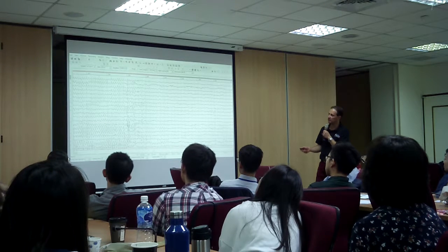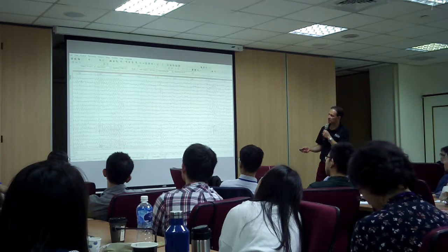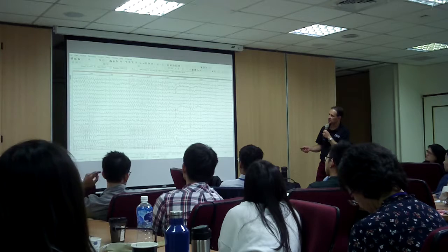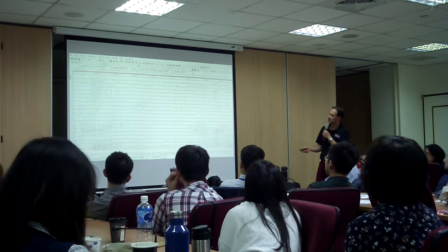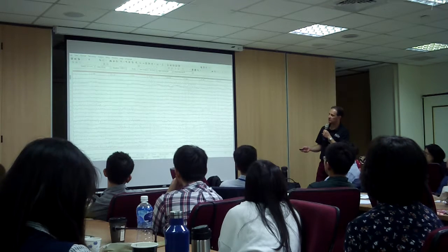Same slowing, right? Now, stop me whenever you want to. Okay, that's a sensor pop. So you see the slowing, right? So we're starting to suspect something.